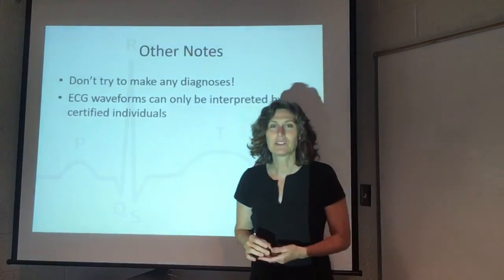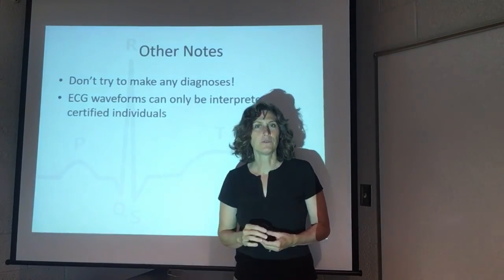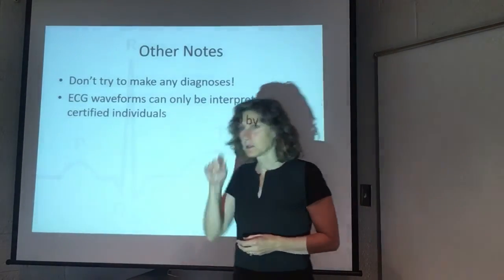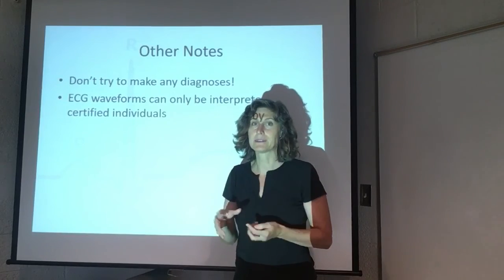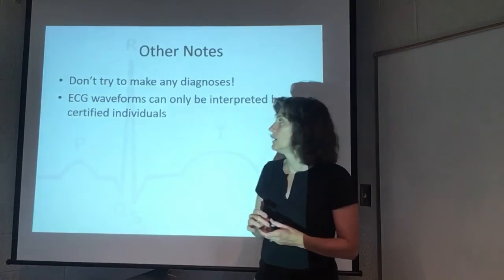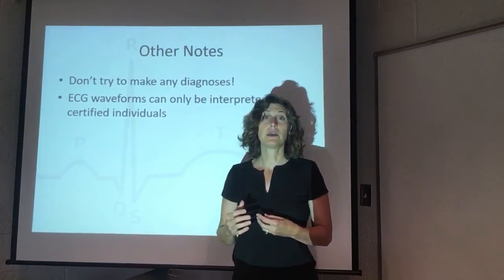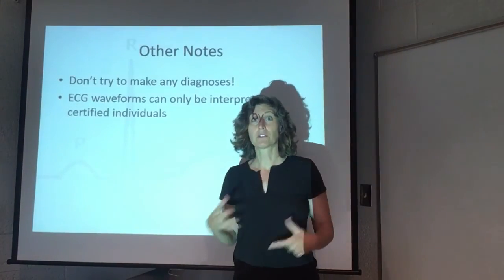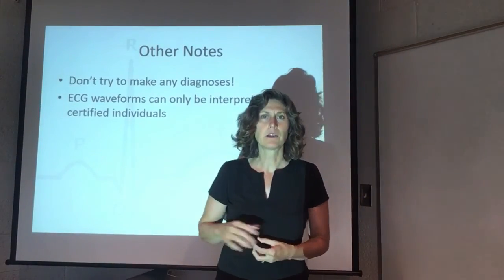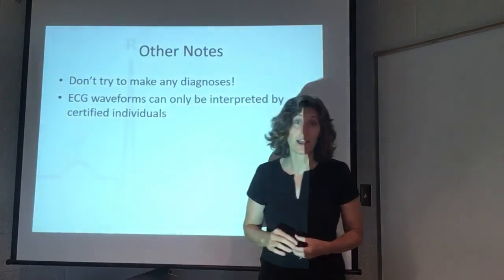Last point of reference, as you're doing your ECG lab: don't try to diagnose yourself. It really takes a medical professional, and it's way beyond the scope of my knowledge, to look at the various beats and the various patterns and say, oh, this is indicative of some cardiac condition. Most likely any kind of aberrant looking things are going to have to do with you being an amateur and running your first electrocardiogram. So don't be worried if it looks like you're flatlining, because again, that's just an artifact of the data, etc.